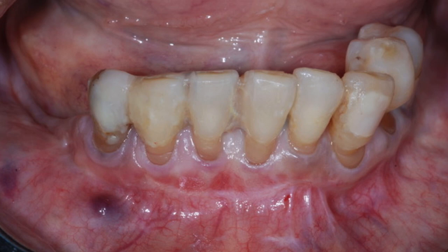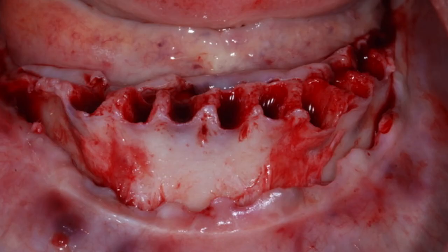I see some mandibular teeth there. Those aren't going to be there very long, are they? Yes. We had initially done her upper arch with zygoma implants, and now she's converting her lower, because of her issues about when she wants her bite to be stable in appearance.